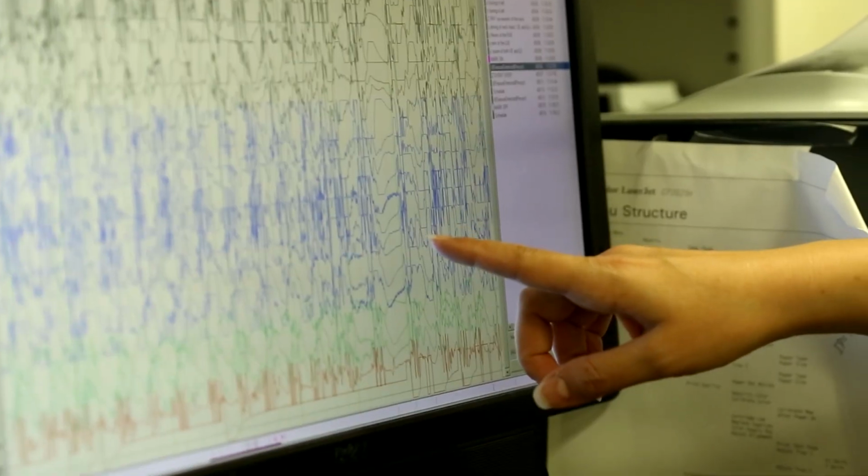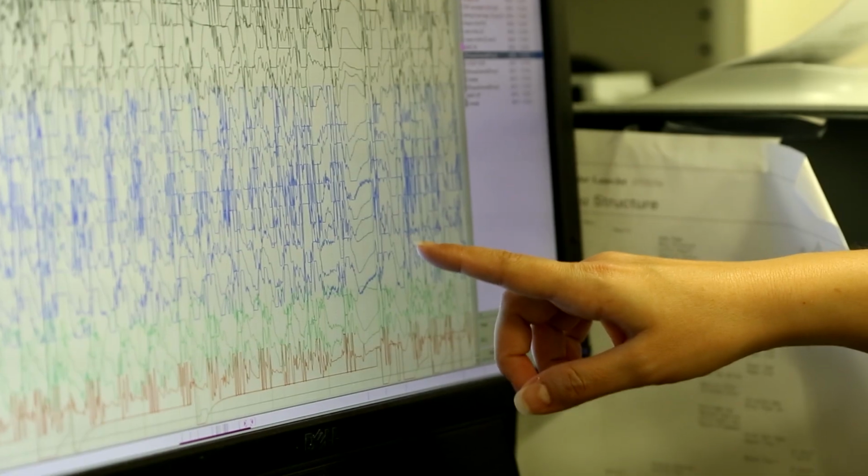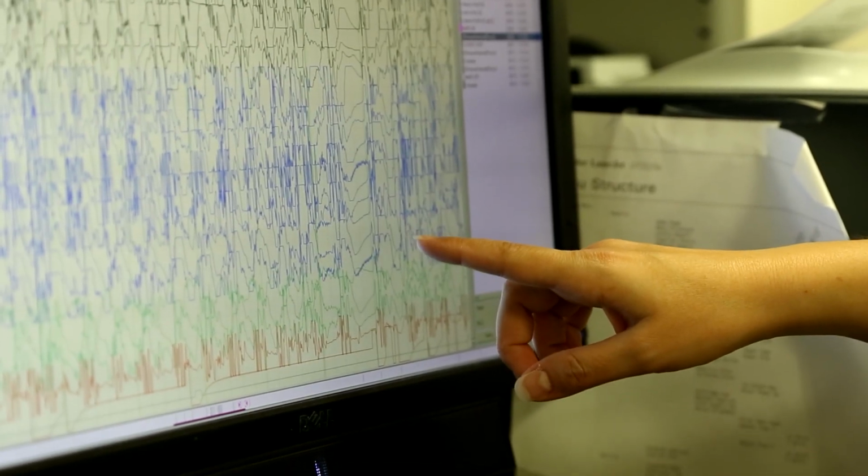While patients are in the Epilepsy Monitoring Unit, the staff can monitor their activity in the monitoring room. They can look at the patient's movements around the room as well as the EEG activity. If they find anything, they can let the physicians know to look at the record. They will also come in periodically to do some maintenance of the electrodes. This includes gelling and replacing them as needed.